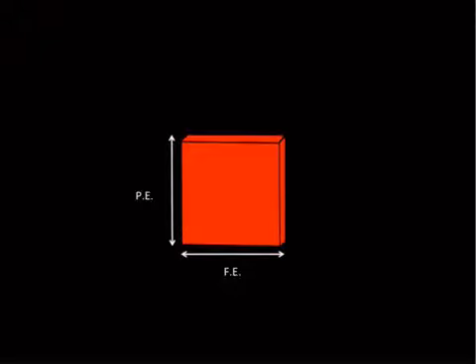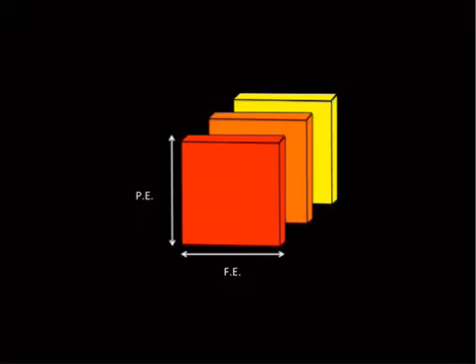Here's a trick. Everything that I'm talking about right now is this idea of 2D imaging. For the purpose of multiple choice, I'll say this a couple of times because it's important: unless specified otherwise, assume that you are doing a 2D type of MR acquisition. So we've got a phase encoding, frequency encoding, and then multiple slices. It's two-dimensional, and then you go on to the next one. So this is 2D, all right?